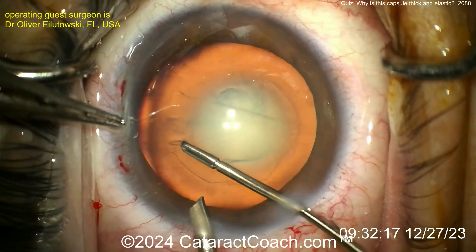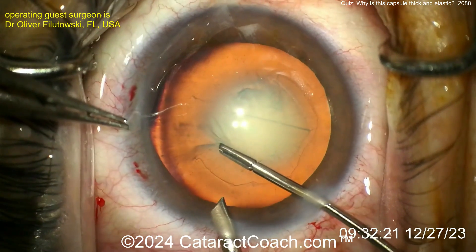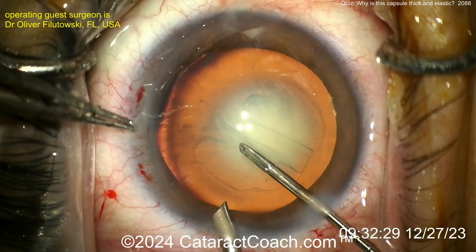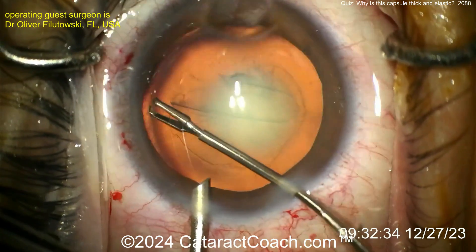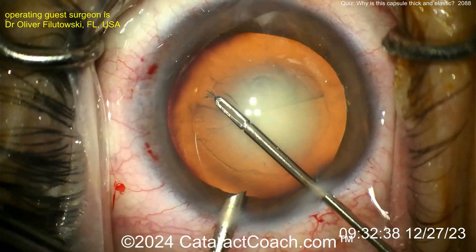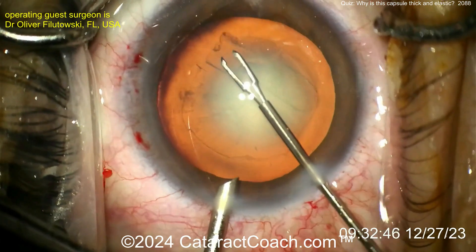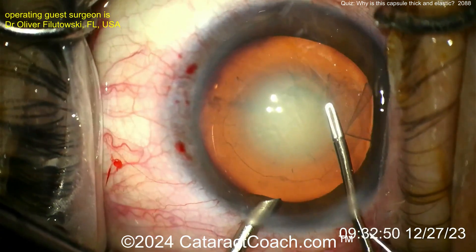I'm not sure exactly why this happens, and it's pretty rare. That little maneuver doesn't want to work with a very thick and elastic capsule. Normally, the anterior lens capsule is about 14 microns at its thinnest, and the posterior lens capsule is about 4 microns at its thinnest. But here it's just taking so long for an experienced surgeon to finish the rhexis — an unusual case. Now the rhexis is completed and looks pretty good.